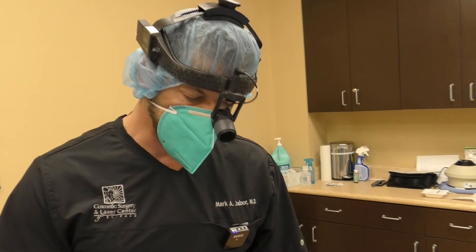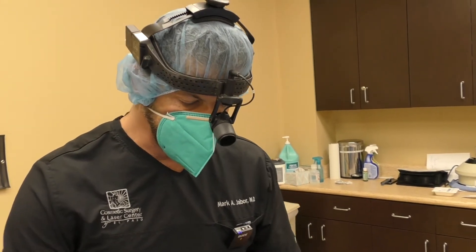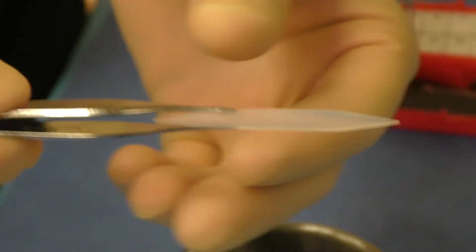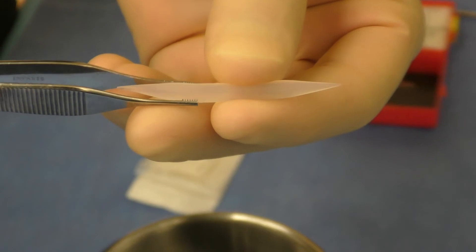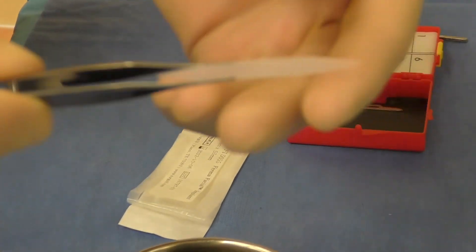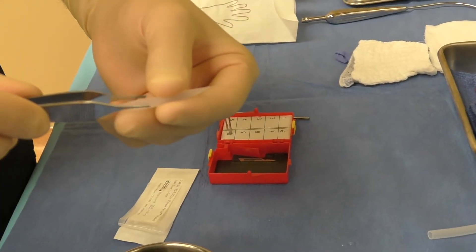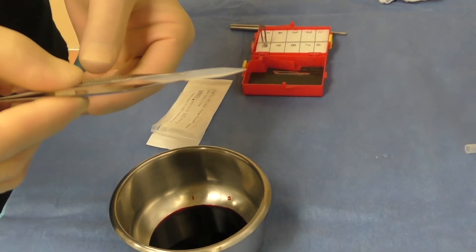We will pull the implant through and center it so that we have it just like we want it. With my hand I can actually adjust it, then we close the incisions and we're done. Here's the implant itself — it's a solid silicone, but it's soft and tapered. This one is a five millimeter. There are three millimeter and four millimeter options. I almost never use a three — mostly the fours and fives. They come in different lengths as well. This is what we're going to place into the lip, and of course it tapers at the ends toward the corners of the mouth. I usually put in a little bit of betadine just to help prevent any type of infection. So we'll place this in and I'll show you as it's going in.